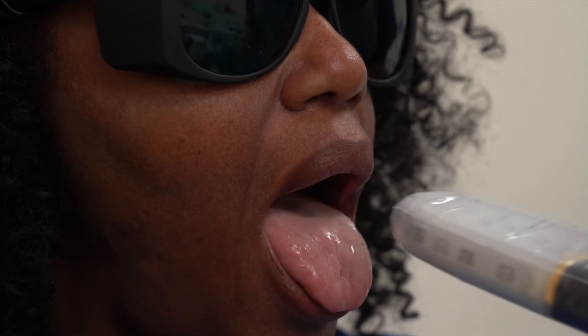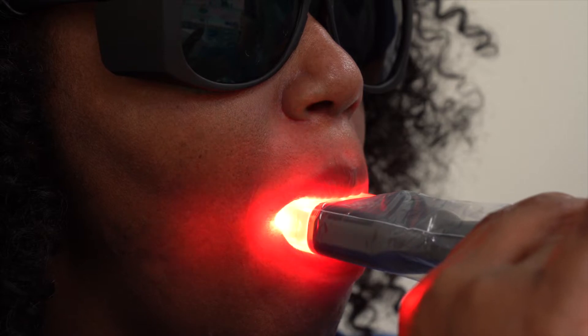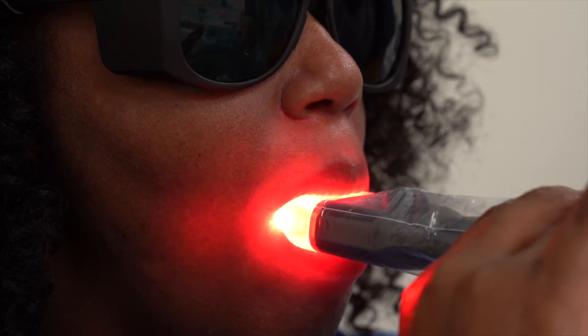There are two intraoral treatment sites: treatment with the tongue at rest and with the tongue raised. Ask the patient to open their mouth with their tongue in a resting position and guide them to place the probe as deep as possible for best effect. If the patient is able, they can hold the probe to give them better control over their gag reflex.